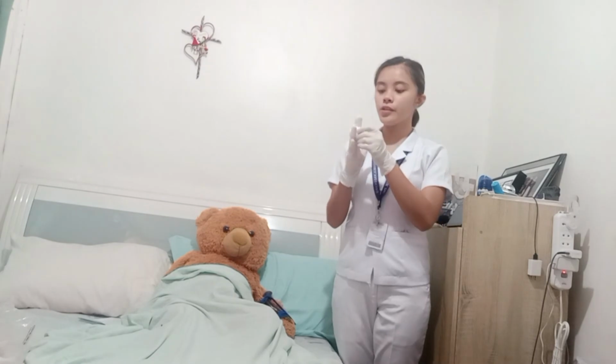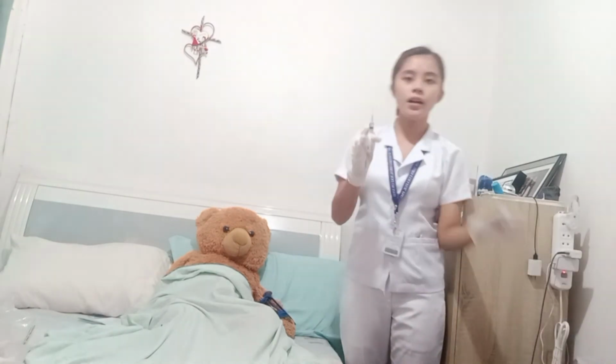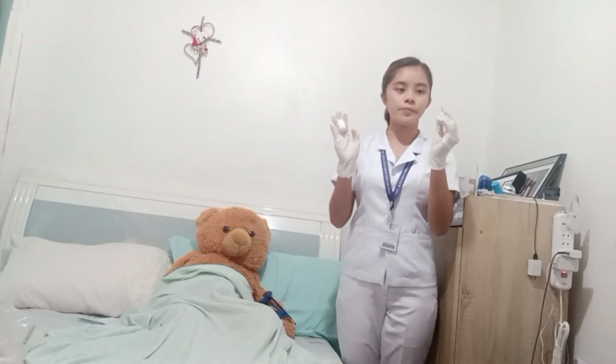Now hold the gauze pad between the third and fourth fingers of the non-dominant hand, and then grab the syringe and remove the cup by pulling it straight off. Then hold the syringe with the thumb and forefinger of the dominant hand as if holding a dart.